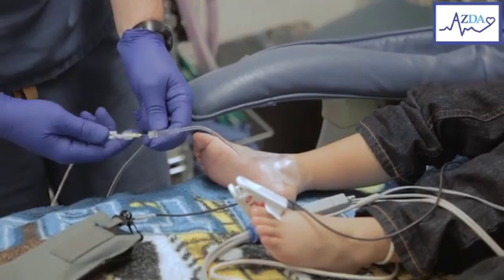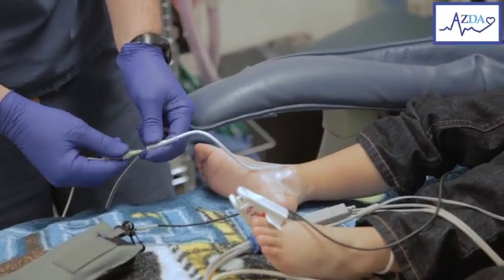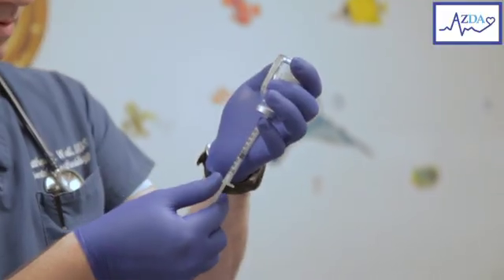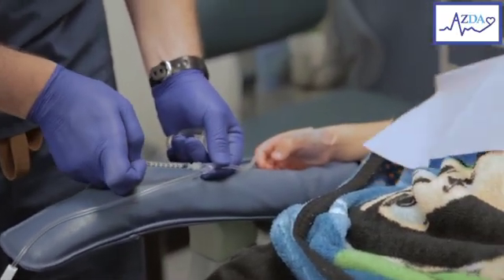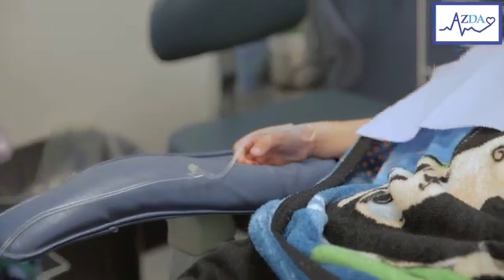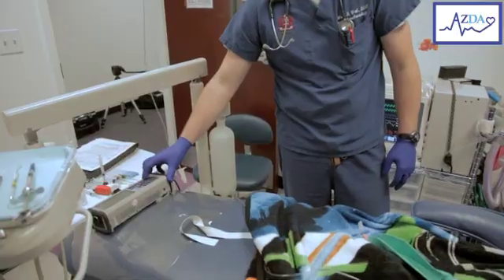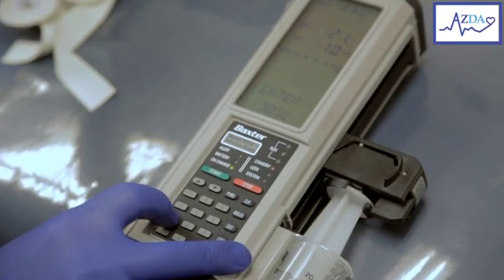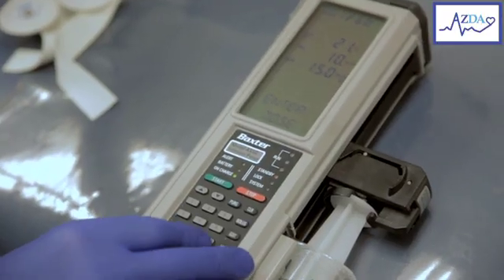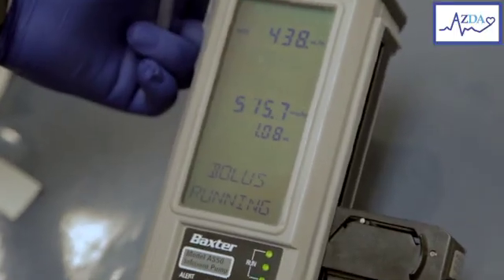Now I'm starting the infusion of propofol and remifentanil. These medications are mixed together in the syringe. Typically I use the mixture of remi-10, though the mixture doesn't matter — you can use remi-5, 7, or 10, whichever you prefer. You can see that I'm giving the patient a bolus of propofol-remi-10. The bolus should be around 1 to 1.5 milligrams per kilo, so in a 20-kilo child this would amount to 2 to 3 mLs of propofol and remifentanil.